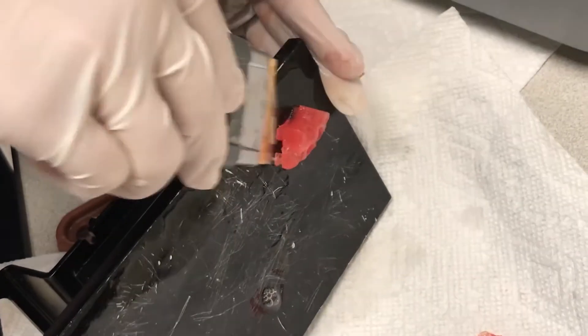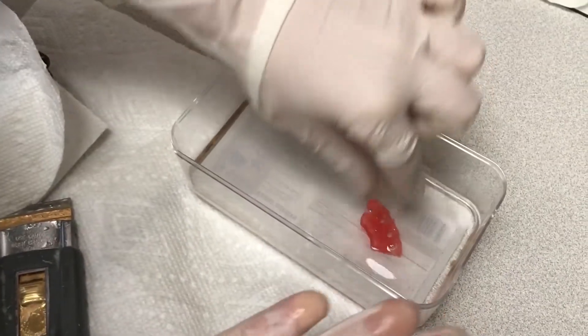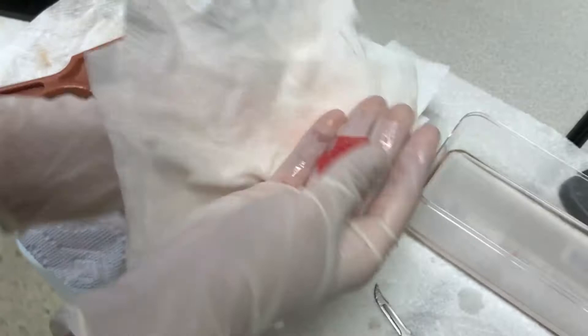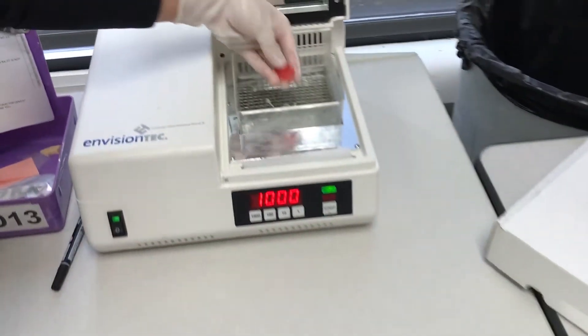Once it has finished printing, we remove it from the printing board, then we soak it in alcohol to clean it. After it has been cleaned, we dry it off and cut off the printing supports. Then we light cure it.